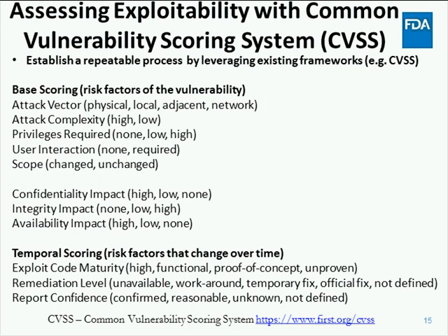With respect to the y-axis, exploitability, the suggested approach is to use the Common Vulnerability Scoring System. We've proposed the use of CVSS 3.0. However, we've received feedback that organizations may also be using 2.0 or both. The guidance proposes suggestions of tools that are security-centric so that manufacturers may adopt and adapt them for their use, and FDA is supportive of the use of tools that facilitate the fulfillment of device manufacturers' regulatory obligations under 21 CFR 820.